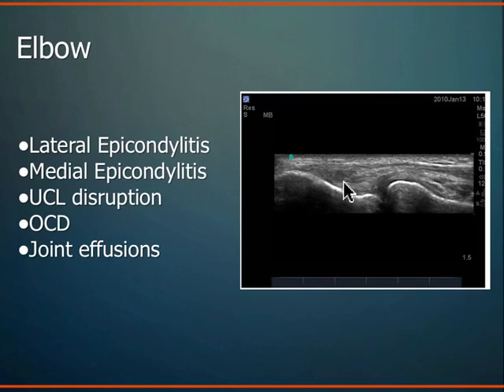And again, you can direct injection treatments in other modalities, new modalities like platelet-rich plasma and some of these things you guys have probably heard about. And you can use the ultrasound guidance very well for that.